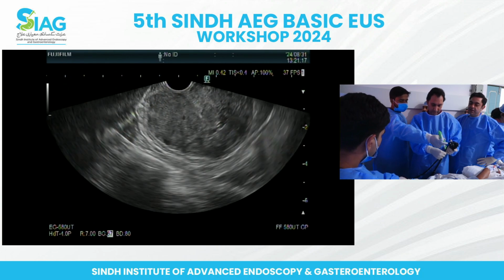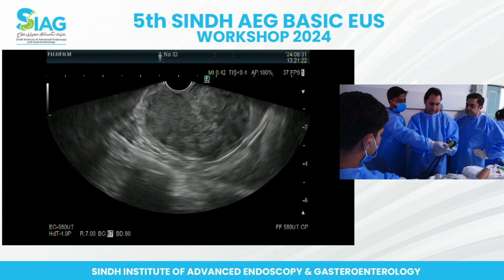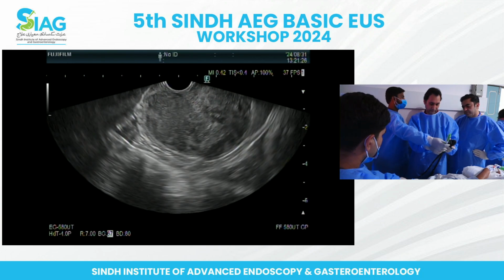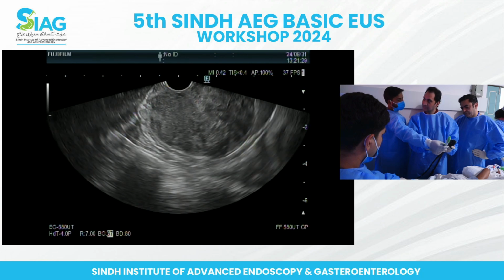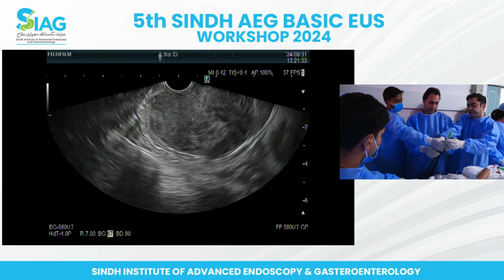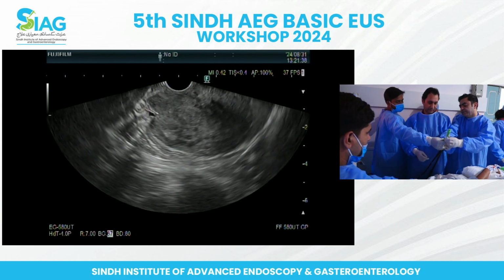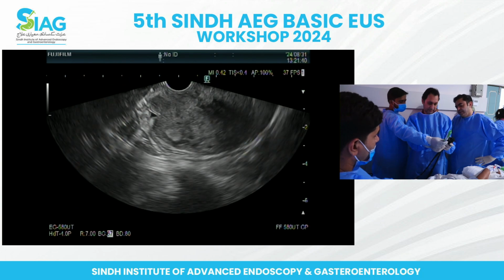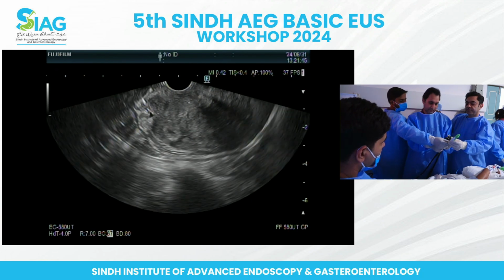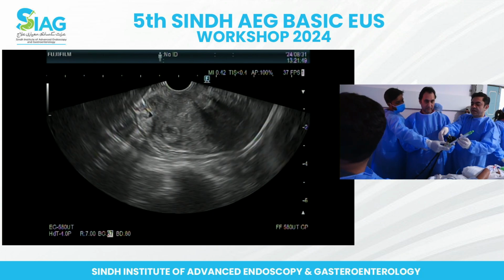in the bottom end. एक सेकंड रुक जाएं और ना नीडल डालें. So you see how the sheath is already so many centimeters out. The recommendation is to have it no more than 2 centimeters out before you put the needle down. So sheath को जरा पीछे. Shahzad, just show him how the lower dial, जो assistant है उनके अपना हाथ हटा दें जरा, just to see for everybody कि भाई there are 2 dials, one for the needle and one for the sheath.